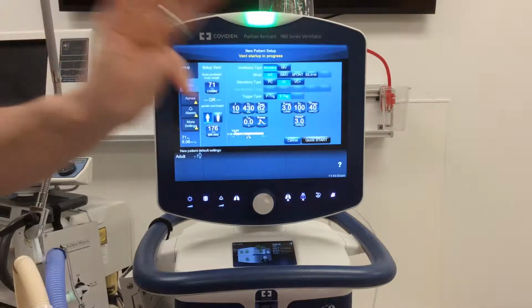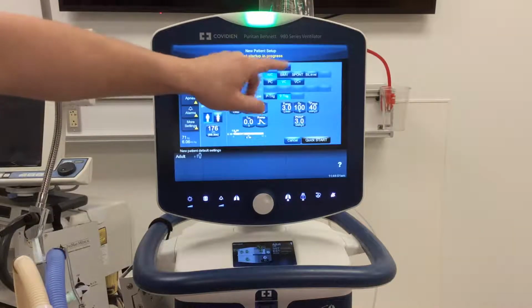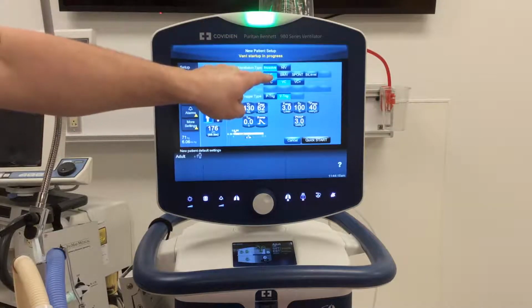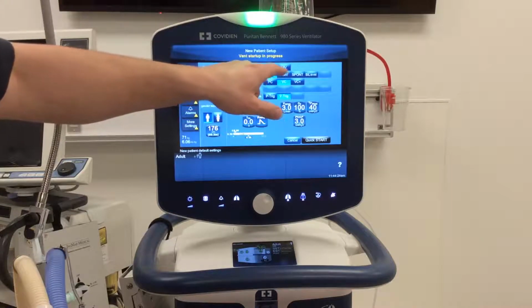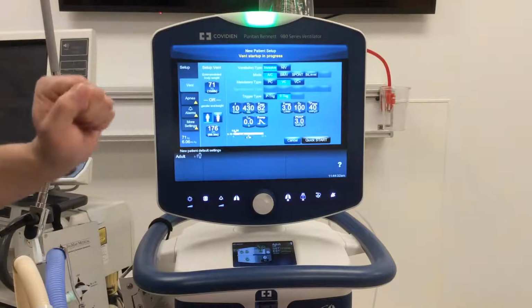Really, there's only 3 modes of ventilation, so I'm not a liar. We'll talk about what bi-level is, but really, bi-level could be branched back into one of our core 3 mode types. So in this ventilator, I like the 840 and the 980 series because they stick to the tried and true, real textbook classifications of mode names. We have essentially continuous mandatory ventilation, or in their sense, they call it assist control, which is a traditional term. SIMV, synchronized intermittent mandatory ventilation. IMV and SIMV we'll talk about a little bit more in the lecture component. And we have spontaneous ventilation.